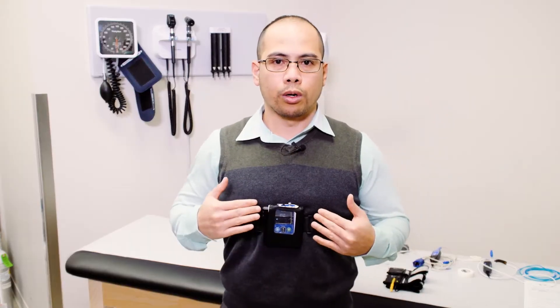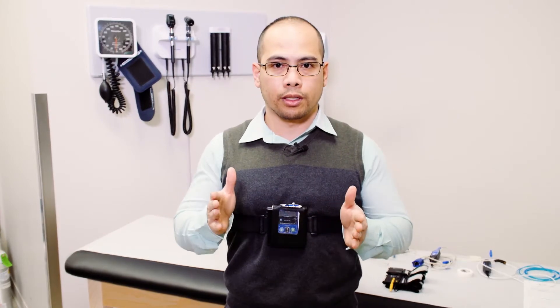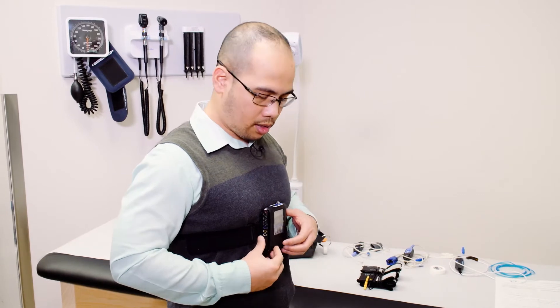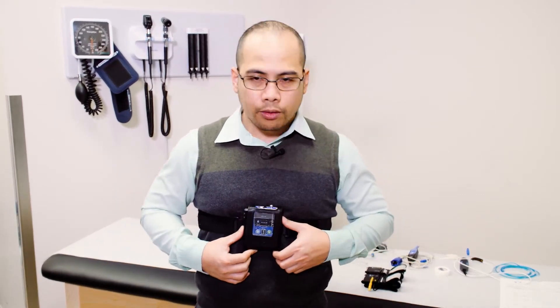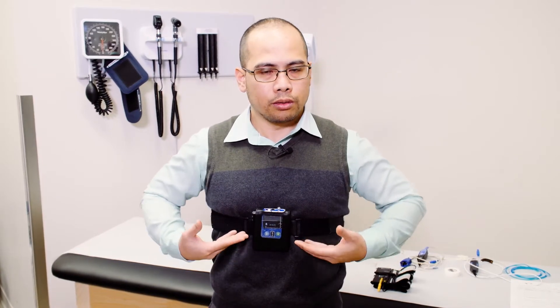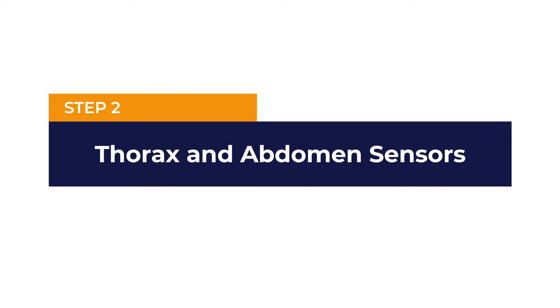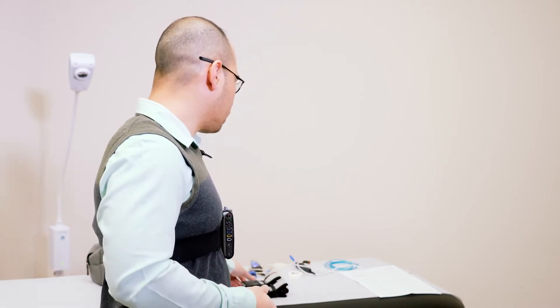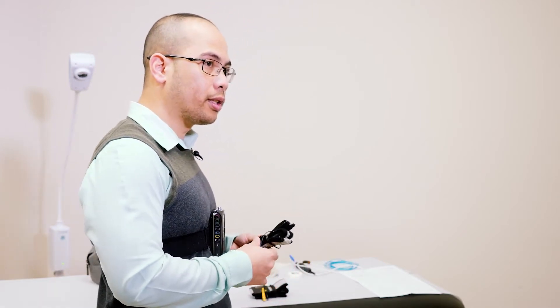The recorder, as you can see, is facing forward. There are ports on the side and on top of it. For ladies, you can just place the recorder just below the bra line. Once the recorder is in place, the next step would be to attach the different sensors.